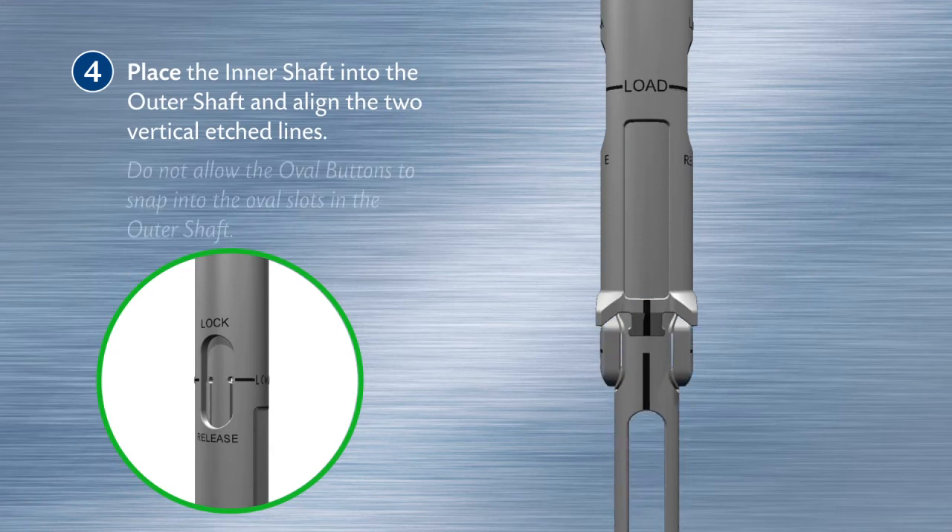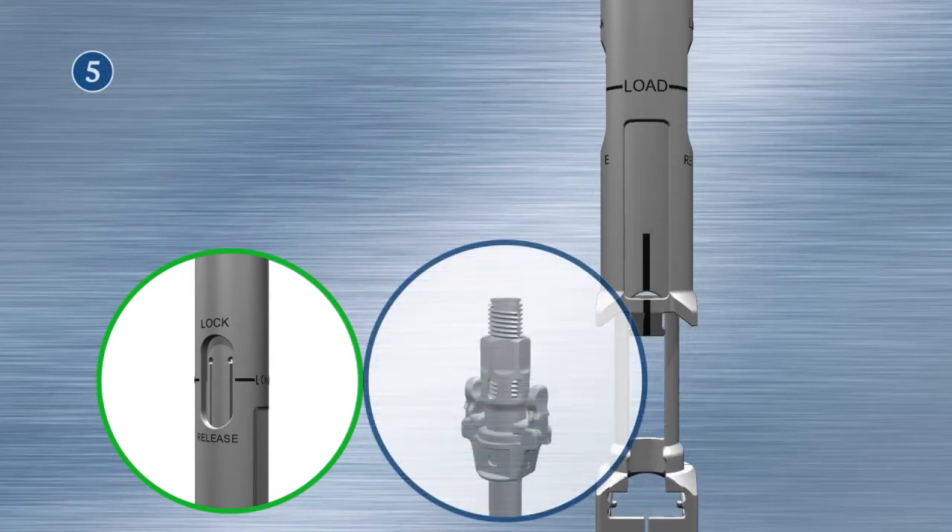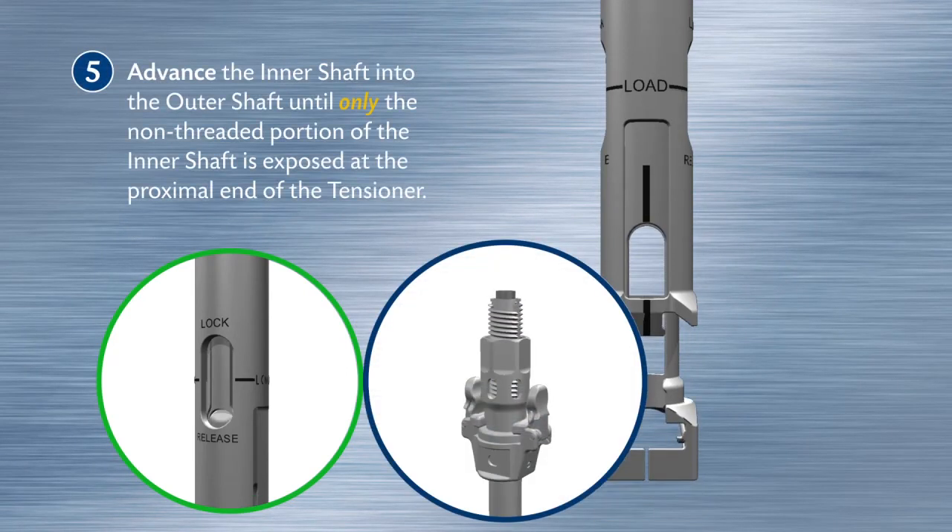Place the inner shaft into the outer shaft and align the two vertical etched lines. Do not allow the oval buttons to snap into the oval slots in the outer shaft. Advance the inner shaft into the outer shaft until only the non-threaded portion of the inner shaft is exposed at the proximal end of the tensioner.